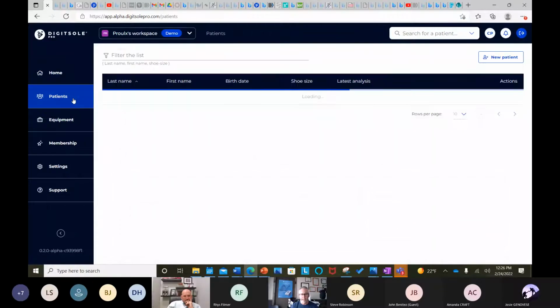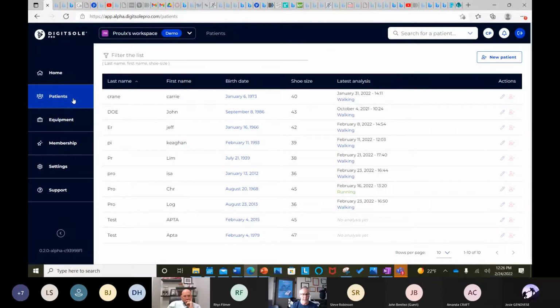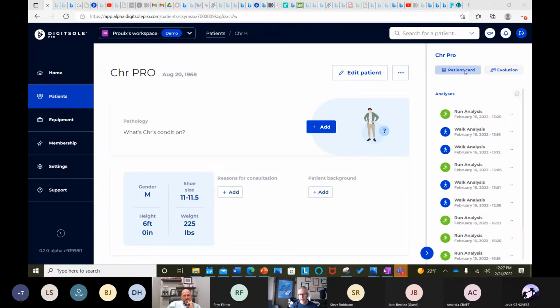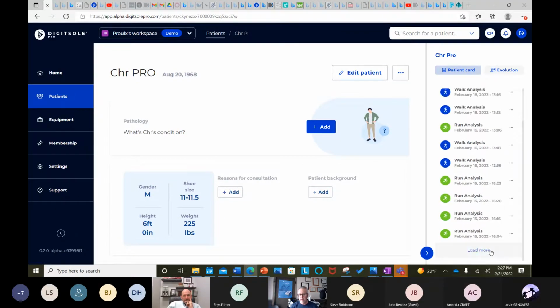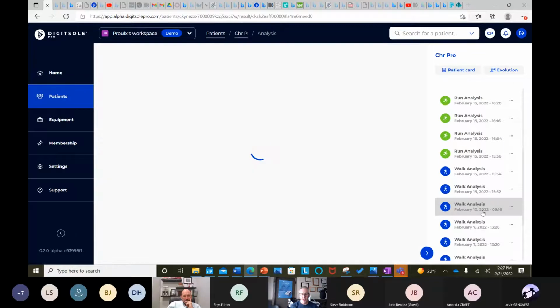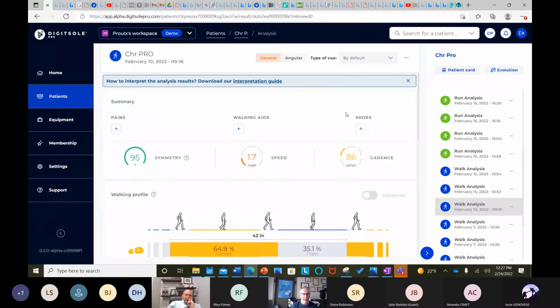So I click on patients here, and I had that first one. So I'm going to pick up, see Prue. And we're going to pull down here because I want to use this first one to sort of outline what we get from these analyses. 916. All right, so here's what we got to give you sort of an overlay.